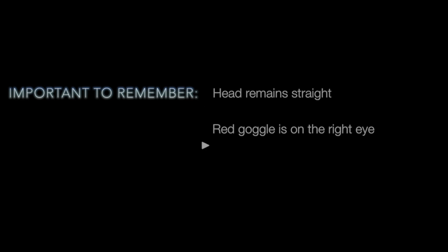During testing, it is important that the patient keep their head straight and both eyes open, that the clinician assist the patient in putting the goggles on with the red filter on the right eye and the green on the left, and that the lights in the room are dimmed. The clinician asks the patient to look down at the chart, straighten their head, and then asks: 'How many dots do you see?' The patient responds: 'Five dots.'